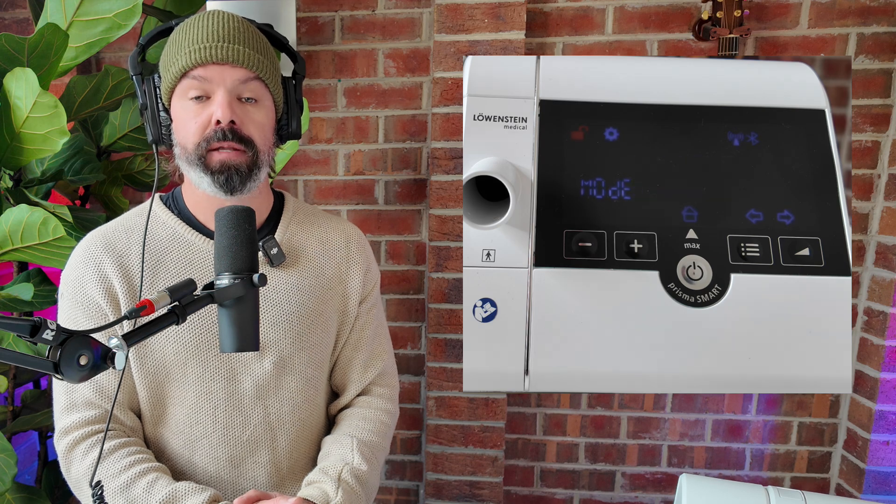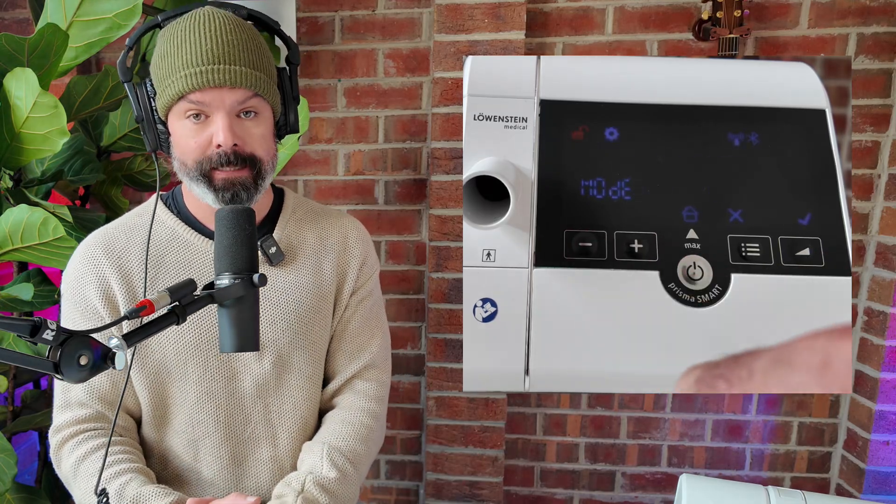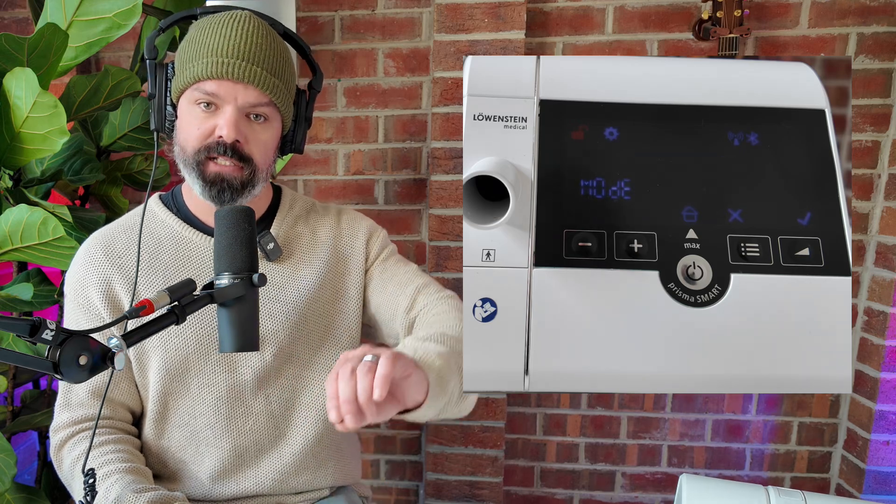The first setting you'll see in the provider menu is the therapy mode, and you can toggle between CPAP and APAP modes by pressing the plus and minus buttons. When it's set to CPAP mode, the device will deliver one set therapy level all night long — no changes, just steady breathing support. But when it's in APAP mode, the pressure automatically adjusts throughout the night depending on what your body needs, so it will move up and down depending on how you're breathing. It's important to note that when you switch between CPAP and APAP modes, the available settings in the menu will change to match the mode that you're in.